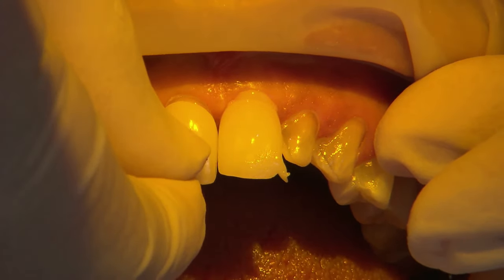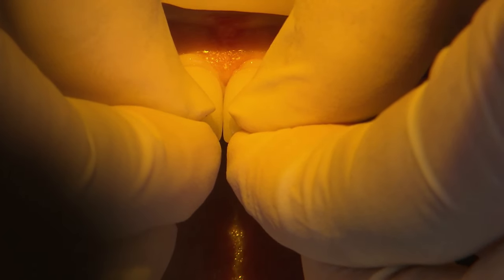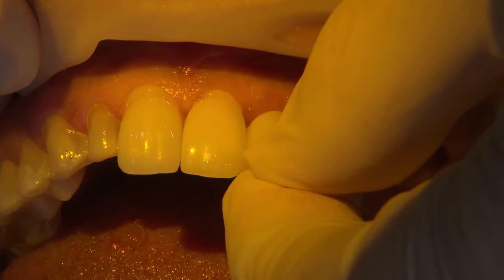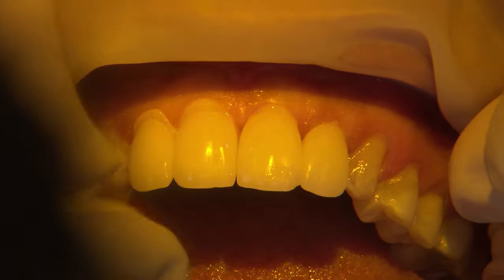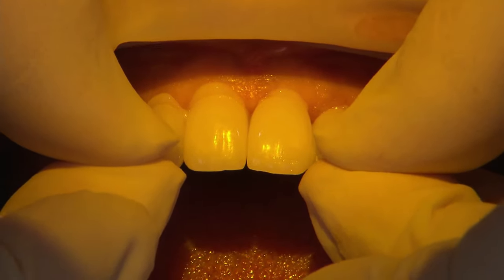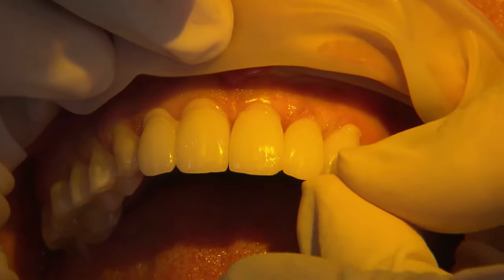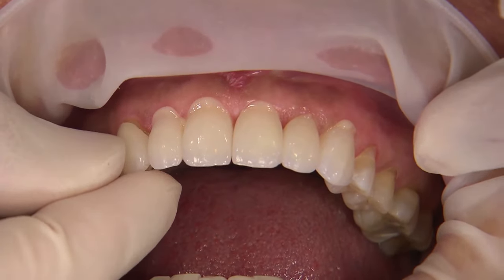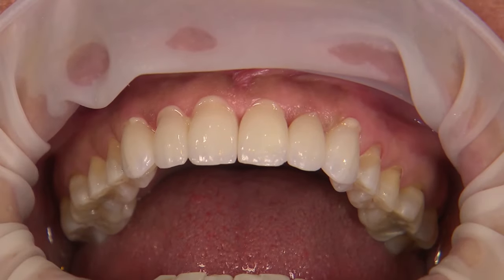In this case I use OptiBond Universal from Kerr, and then Kerr's NX3 light-cured resin cement. I start at the centrals when cementing, locking each one on. It's important during the try-in to make sure they fit passively, so that when you go to cement them, you can get them to the ideal position. Because of the unlimited working time with light-cured cement, I take my time, make sure I load each restoration correctly, and seat them all the way back.